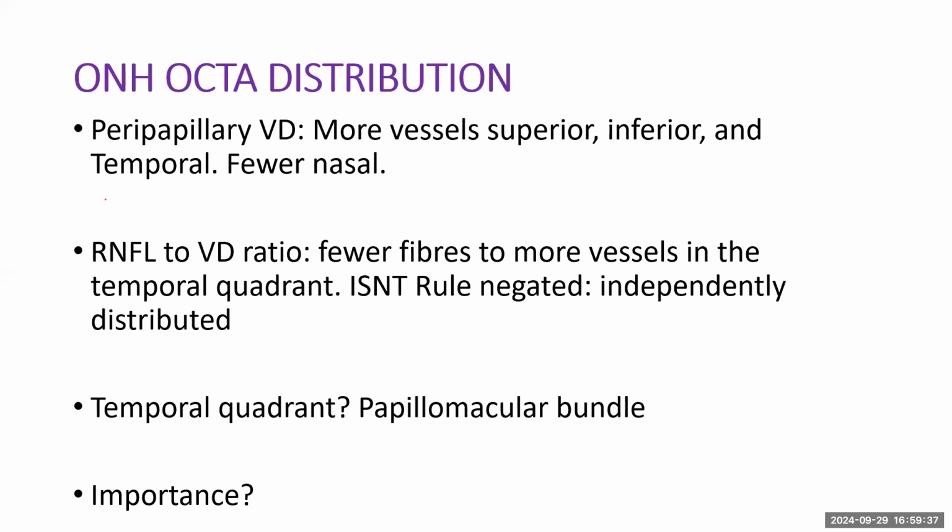So I will say, and other persons have actually noted, that the resistance to glaucomatous damage is attributed to the central part of the vision. As we'll say, the tail end is tunnel vision, the superior fibers are affected, the inferior fibers, but the central part is still there. Could be due to this vascular supply that makes it more resistant to glaucomatous damage. So that's the thought I had after we found this out, okay?